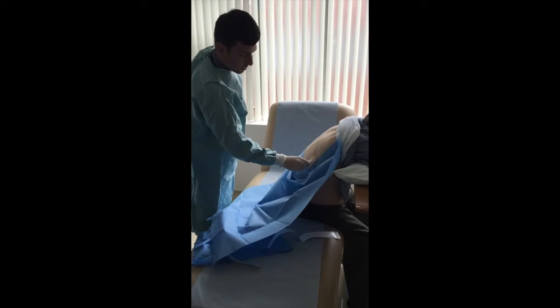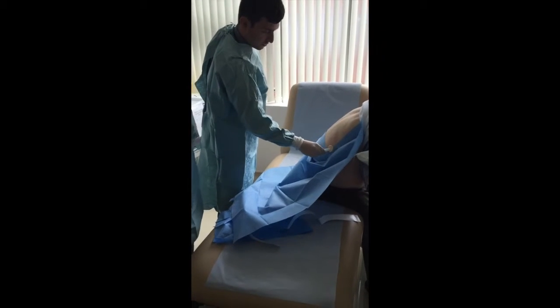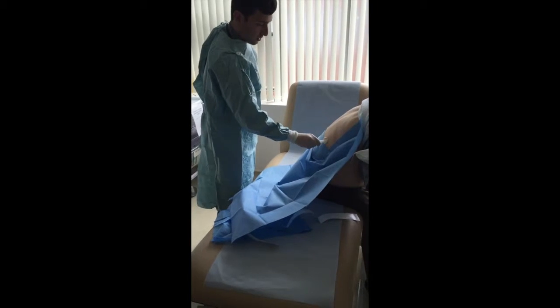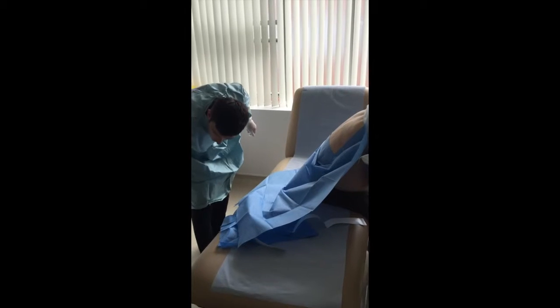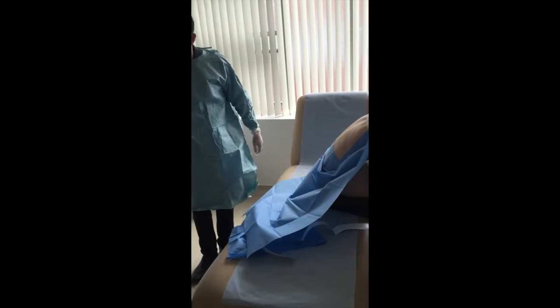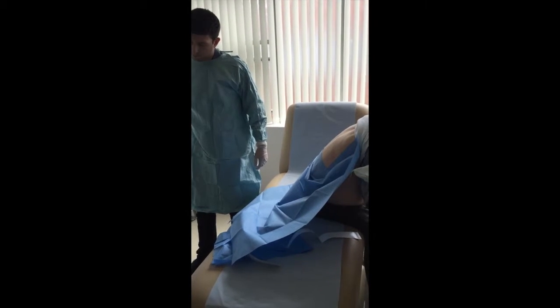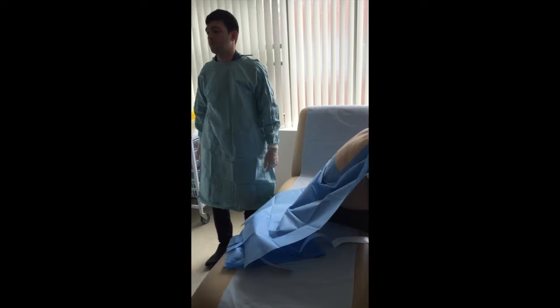That's just with Chloroprep. And just while you're doing that, I'll just draw up some lidocaine. It's 1% lidocaine, 100 milligrams. We tend to use 1% here because you get a better volume of distribution. But there's a maximum of 3 milligrams per kilogram, so you need to be aware of body weight. Yes, that's drawn up.